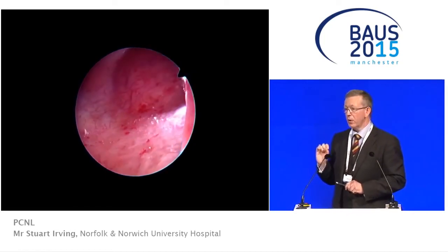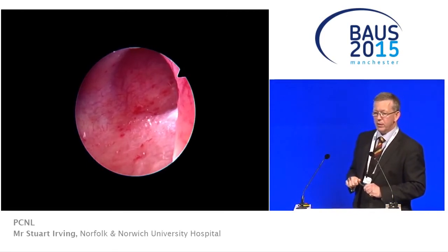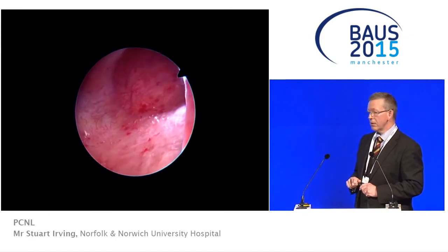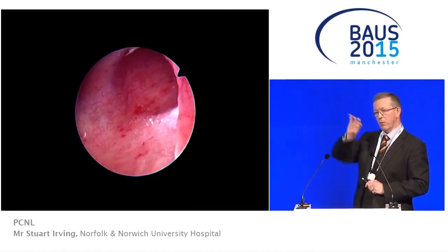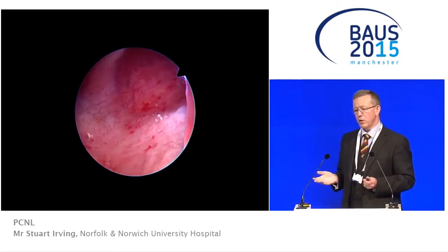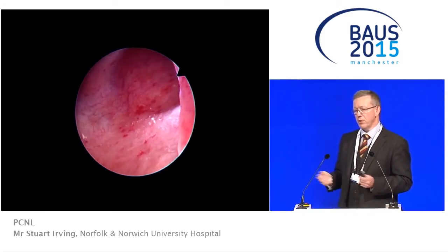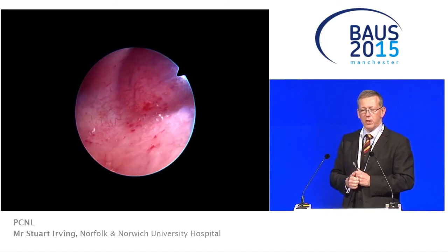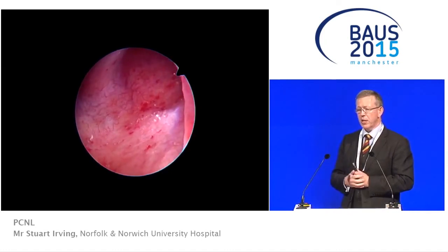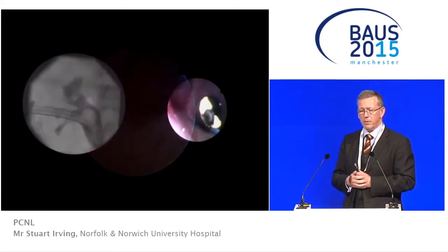Thank you. We've got questions coming thick and fast. Why didn't you use a flexible nephroscope instead was a question, but I think the video has subsequently gone on to show, we just wouldn't have got that round the angle. Our preferred choice, certainly with prone, would be to just use a flexible cystoscope and then just do a quick nephroscopy. But in this situation, clearly that wouldn't have picked up that fragment.